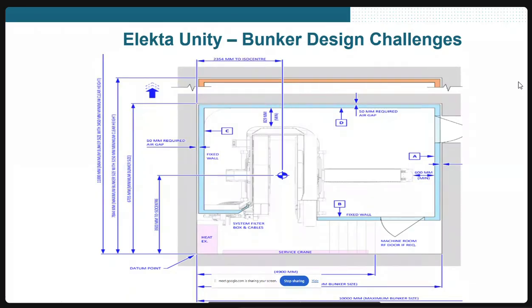And please remember that it's two machines. It's an MRI and a LINAC. So it's two machines sharing one isocenter. In that case, we cannot take either of these machines as a reference, because one machine depends on the other. So what they have done is take the room dimension as the fixed point from which the isocenter is always fixed. So in any MR LINAC center, the corner of the room is taken as a reference, and the isocenter is always at a finite distance from there.